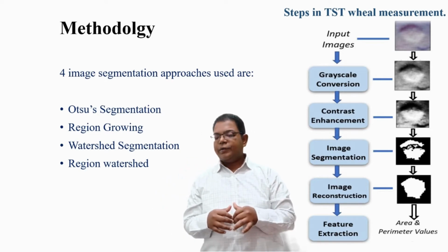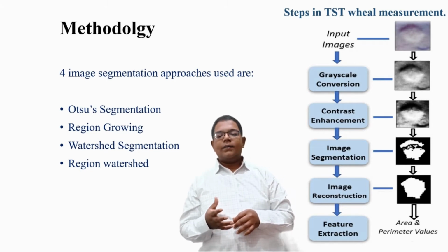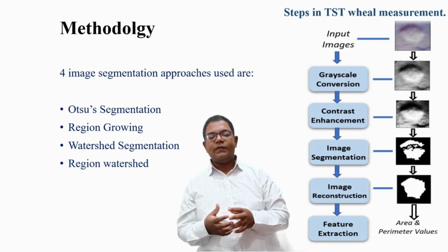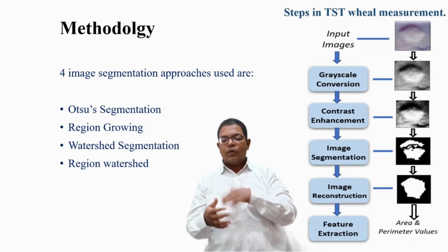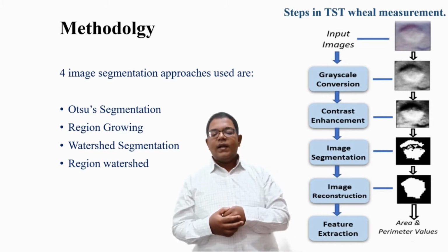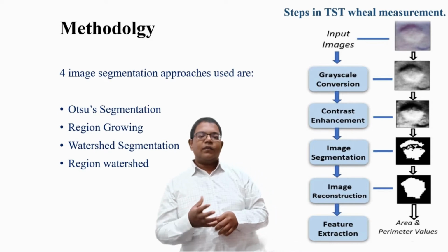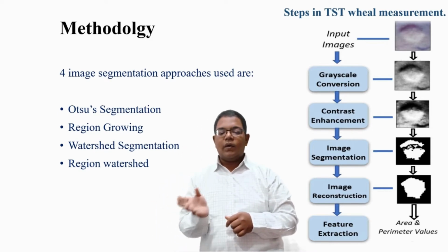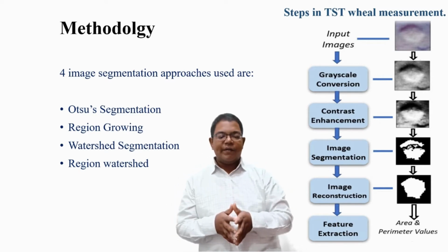The second approach we tried was the region growing method. First, a number of seed points are defined individually on cropped images at the upper intensity and the lower intensity levels. Then the individual seed points are examined for their closeness to the marker values or the seed values, and they are labeled as 0 or 1 based on the threshold defined on the difference in the intensity levels.